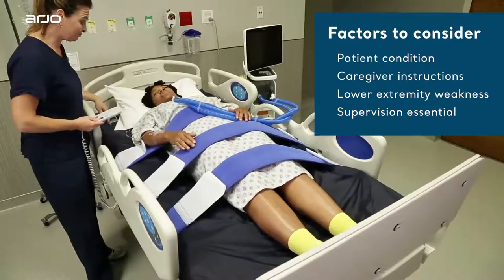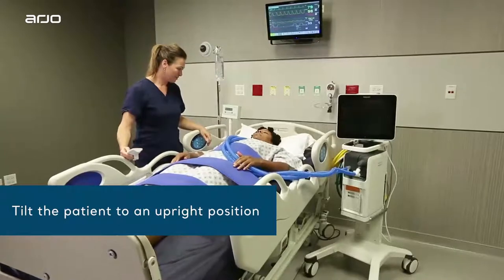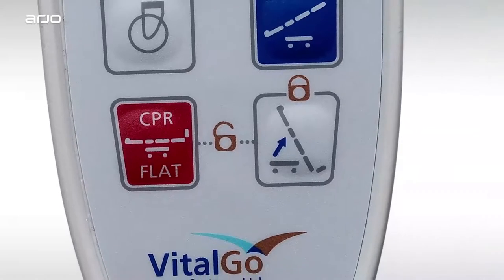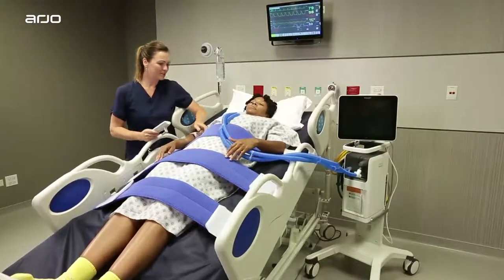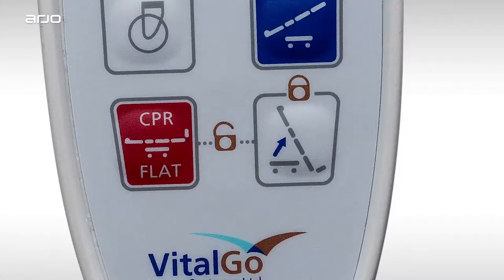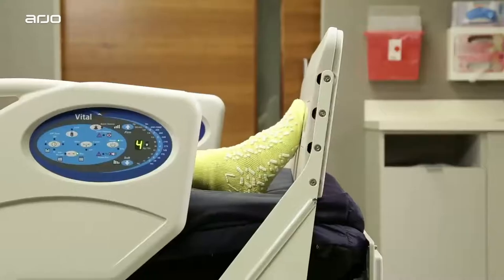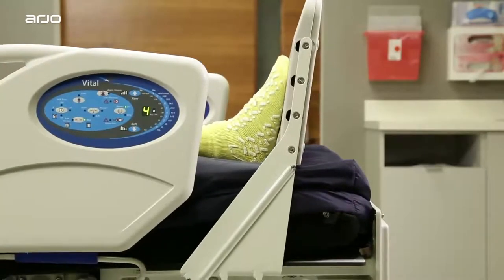Patients should always be supervised by a caregiver when using the tilt function. Once properly strapped in, the patient is ready to be moved into an upright position. Just press the tilt button to engage the Total Lift Bed upright positioning mode. If nothing happens, the bed may be locked. To unlock the bed, press these two buttons at the same time until you hear two beeps. You'll notice that the foot lifter will move in to gently meet the patient's feet, stopping once it senses the weight entered during the scale calibration process.